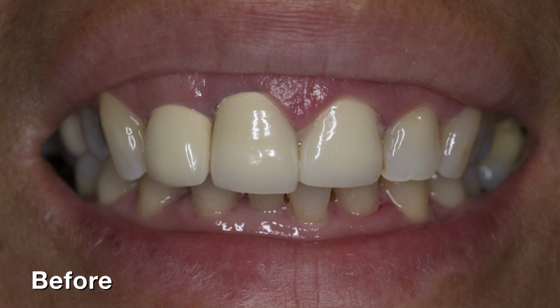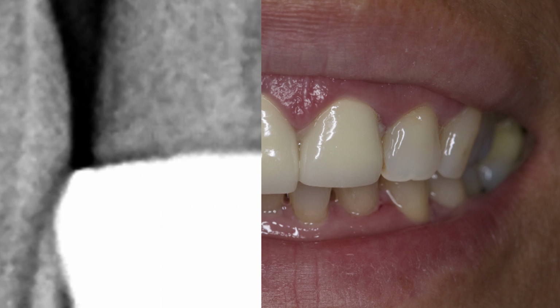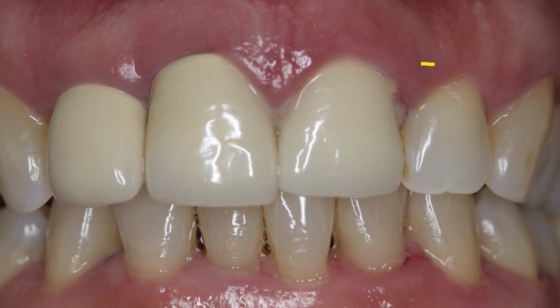the impression tray. These PFM crowns have been in place for a couple of years, and as the gingival recession took place around number 8, the low value around the margin can be noted. We can also note the gingival inflammation, especially around number 9. On number 7, an open margin was also visible on the X-ray. There is also a gingival disharmony I will try to correct with laser.